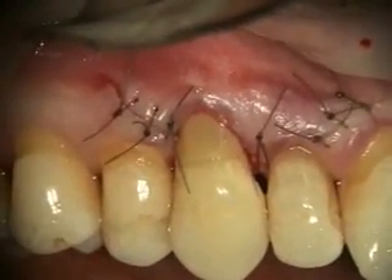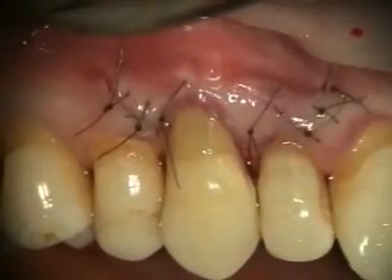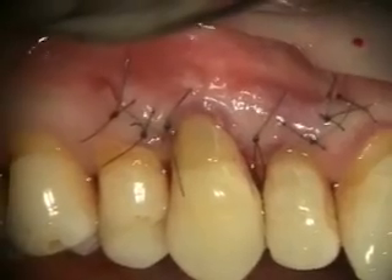We've got the suturing done. We're going to put a little chlorhexidine on there, and we'll just have them dab it on there twice a day. Check it out in a couple of weeks.